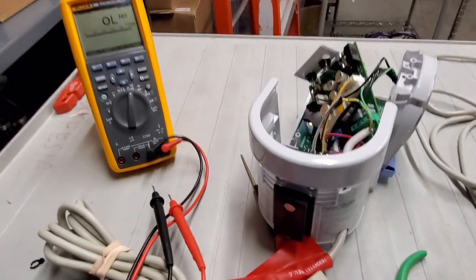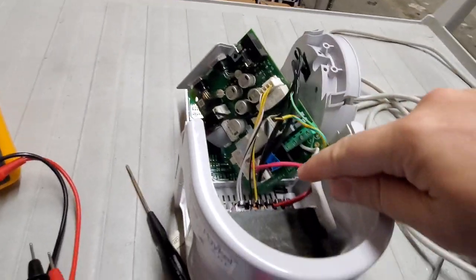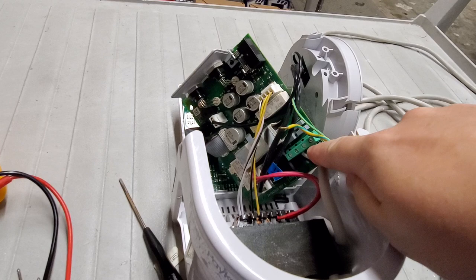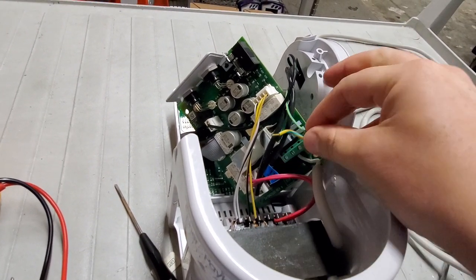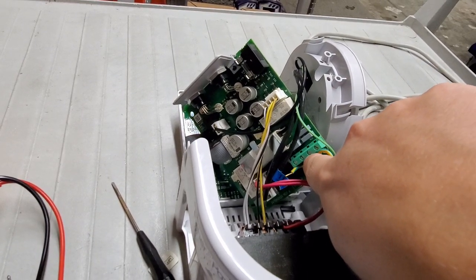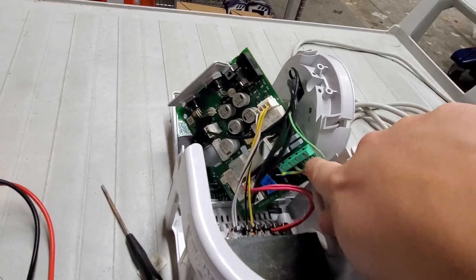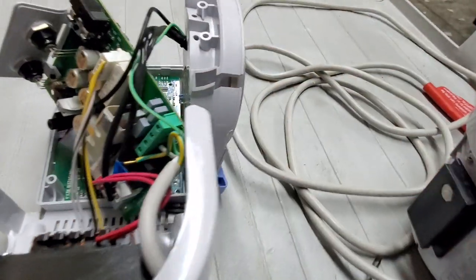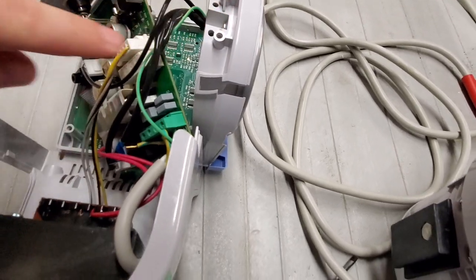Alright, here I got the inside of the Fisher & Paykel. You can see that the AC mains comes into here. There is a ground bus. So this main ground lead right here comes in, it connects to that second screw down right there. And then this first one, this little skinny guy right here, the little green one right there goes to the platter itself.